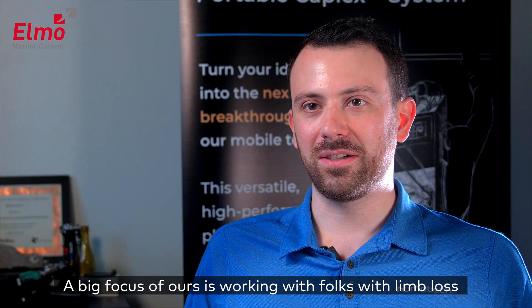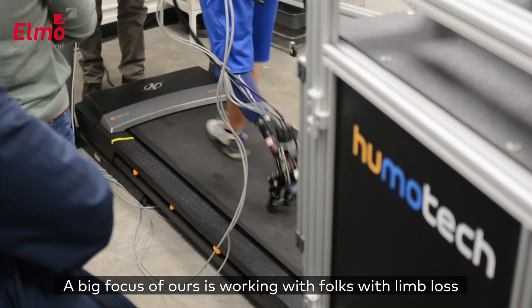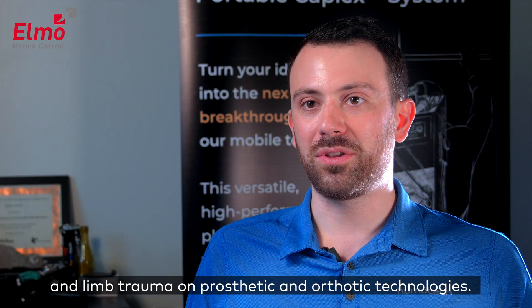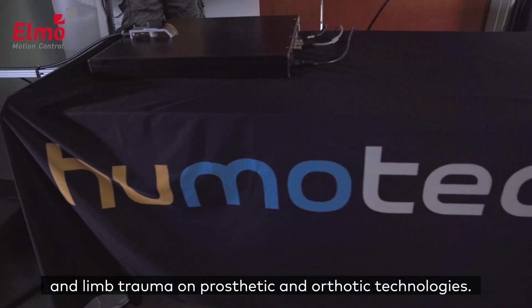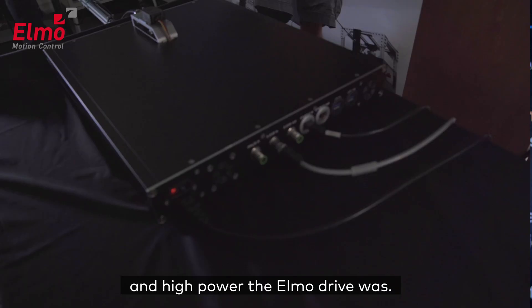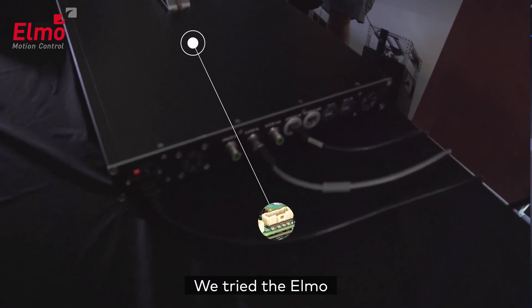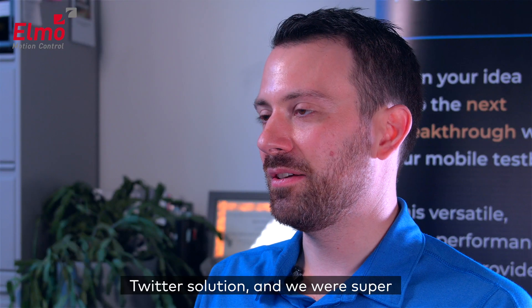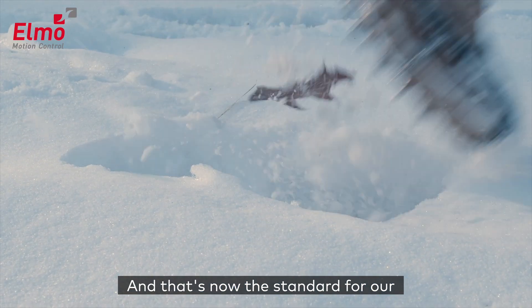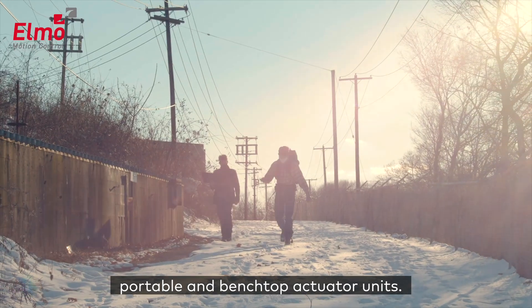A big focus of ours is working with folks with limb loss and limb trauma on prosthetic and orthotic technologies. We're really impressed with how compact and high power the ELMO drive was. We trialed the ELMO Twitter solution and we were super happy with it — that's now the standard for our portable and benchtop actuator units.